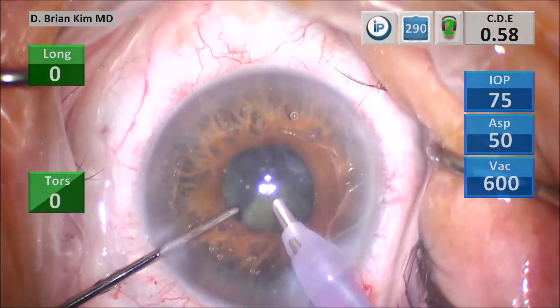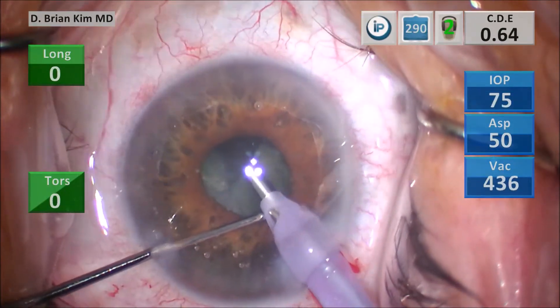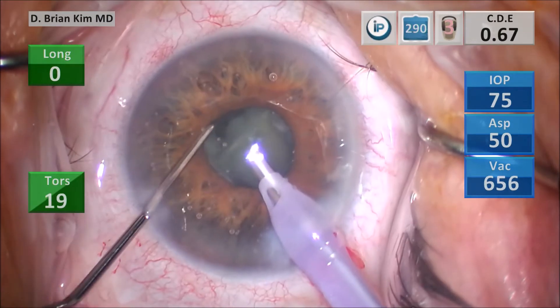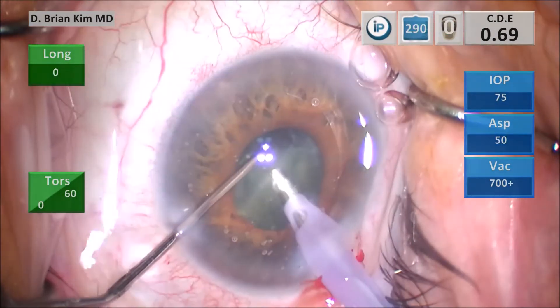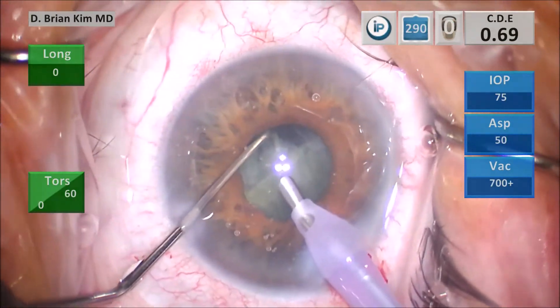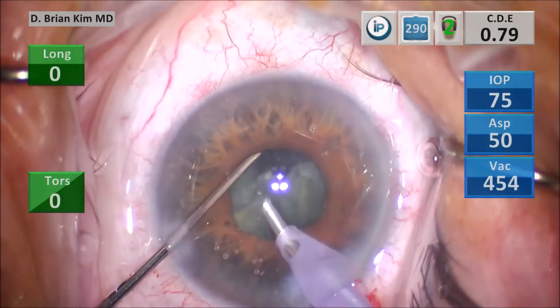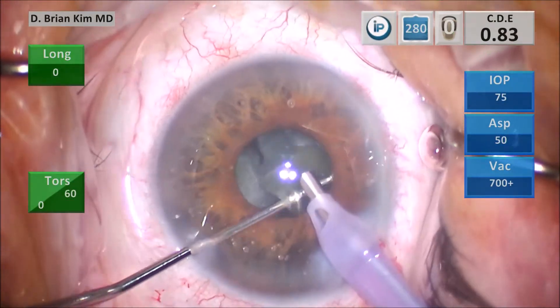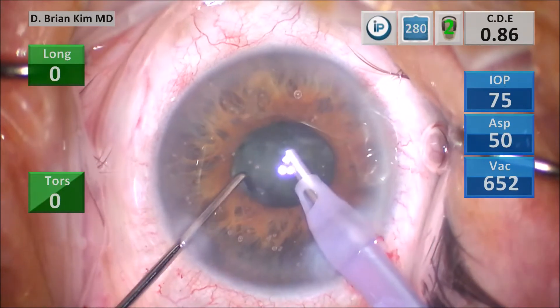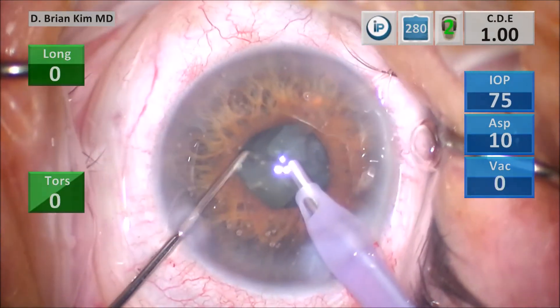I pull that piece into the center. You can see the iris trying to come forward — that's fine, I can use my chopper to hold the iris back. I sandwich the lens pieces, break them into smaller pieces, and then emulsify. By not using ultrasound or vacuum during the chopping and disassembly steps, I minimize exposure to the iris and the posterior capsule.